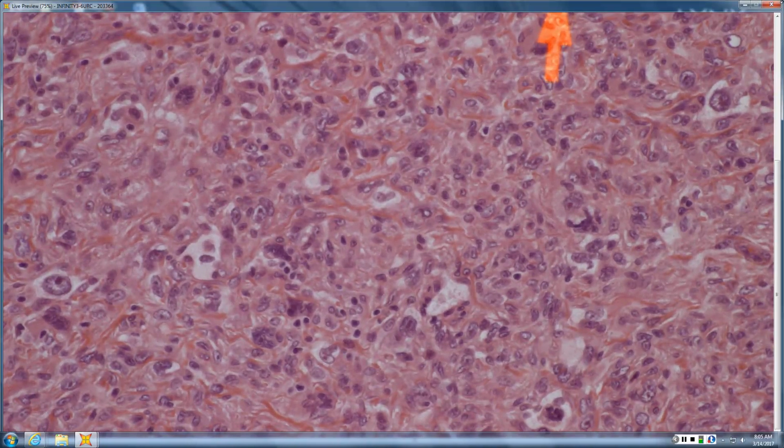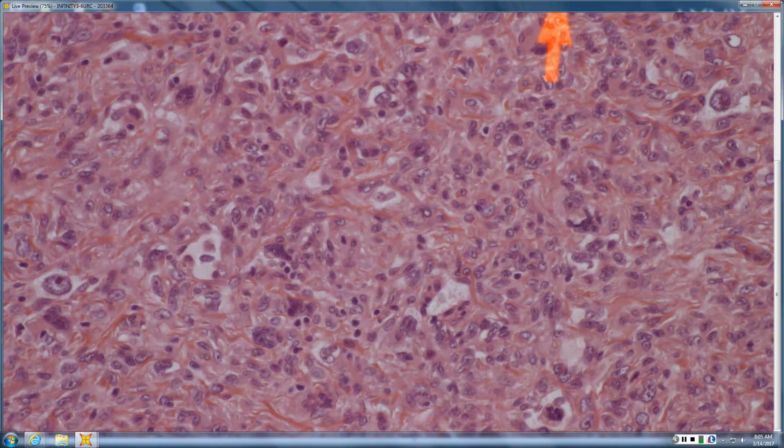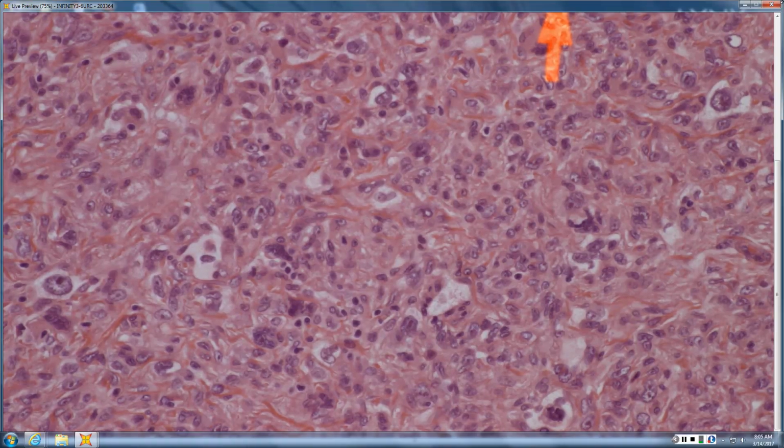So the differential is a translocation sarcoma. That's uniformly hypercellular, with pretty bland cells. It looks nothing like the big monster cells that you get in DF, so they don't scare you, because your big differential isn't something with big ugly cells, right? It's a translocation sarcoma that's uniformly hypercellular across the field. So you handled it absolutely correctly.